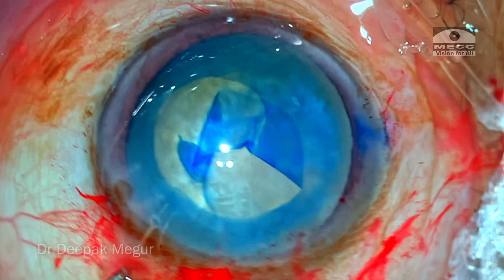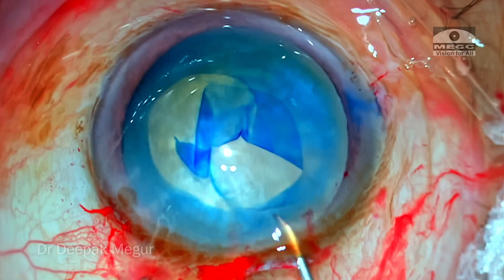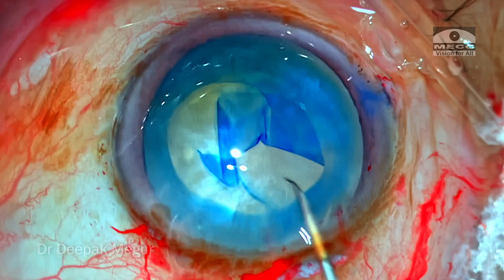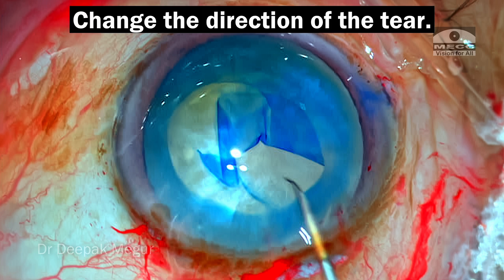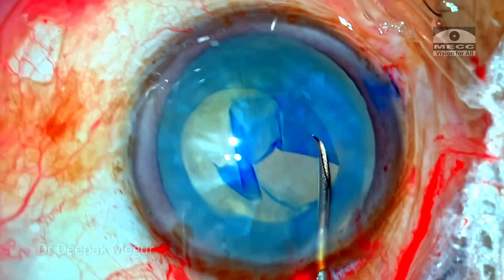Before the surgeon resumes the rhexis with the cystotome, let me pause here and show you the direction of the tear. If you just continue the same way, it's heading towards the equator now itself — it's very evident.